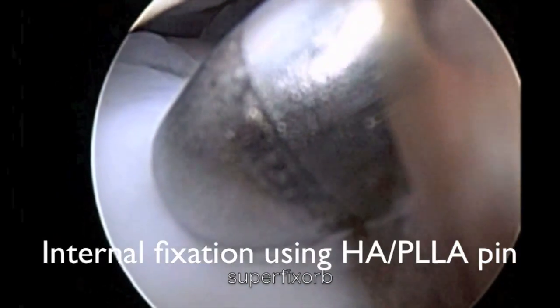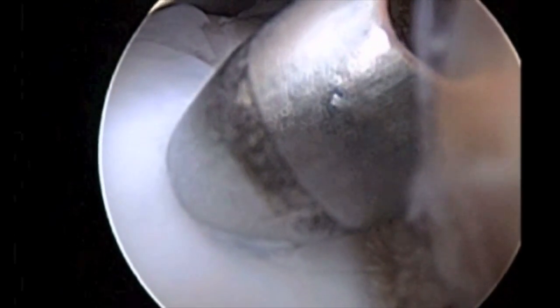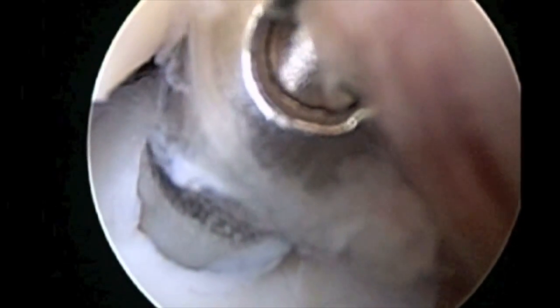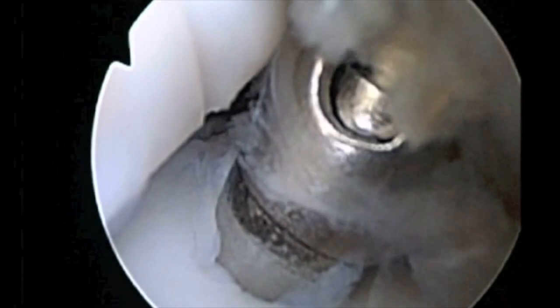A guide tube of 2.0 mm in diameter was then inserted and drilled using a Kirschner wire. A guide hole was made to the appropriate depth using a custom-made tapping bit.